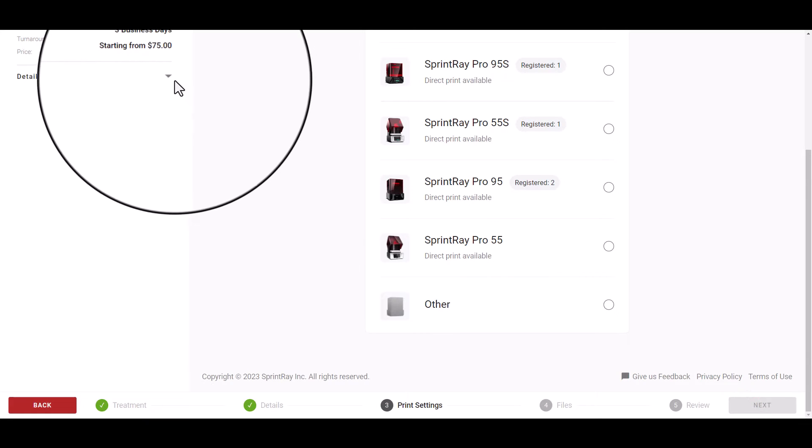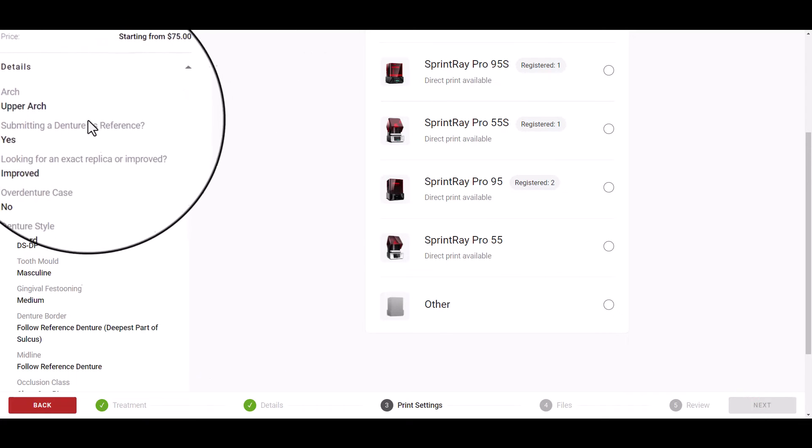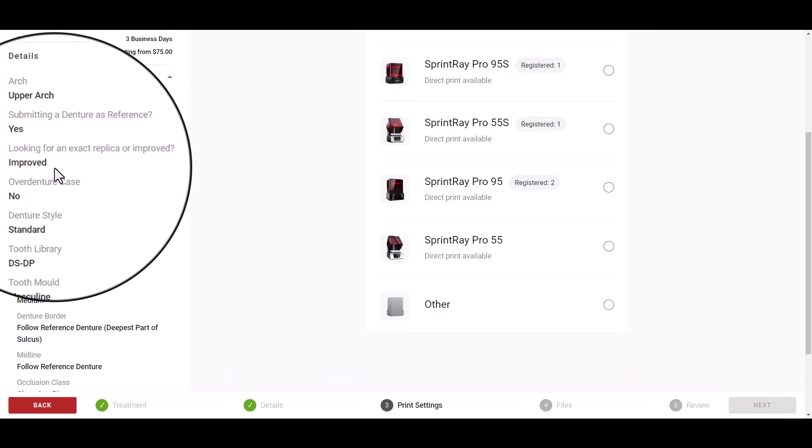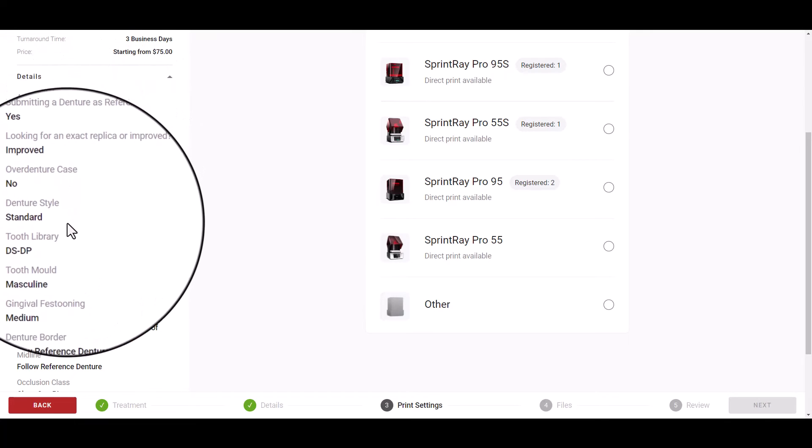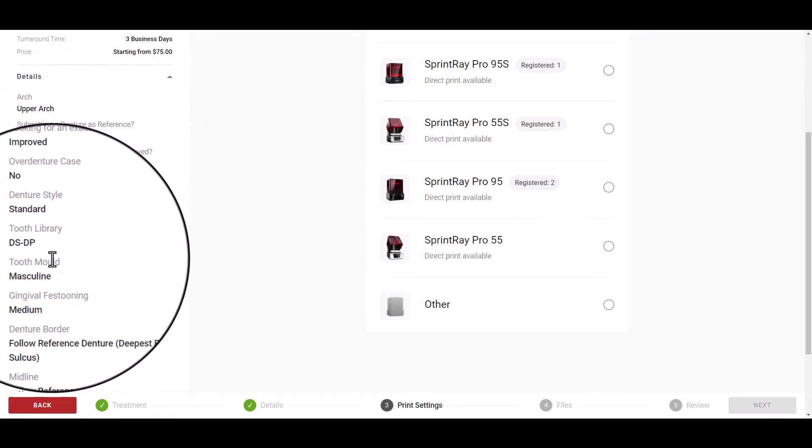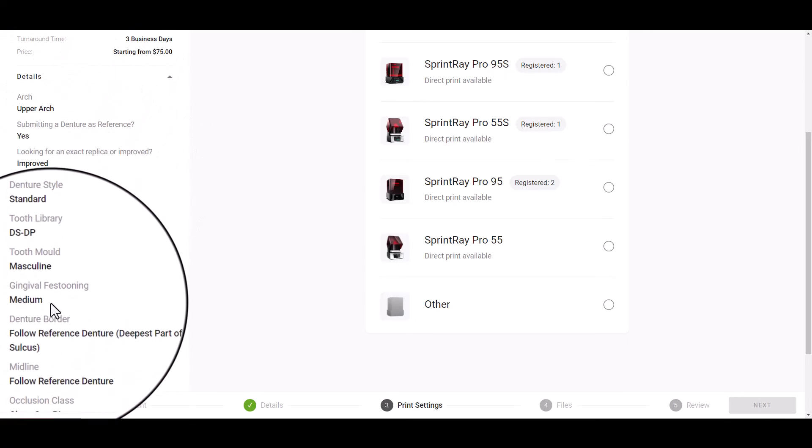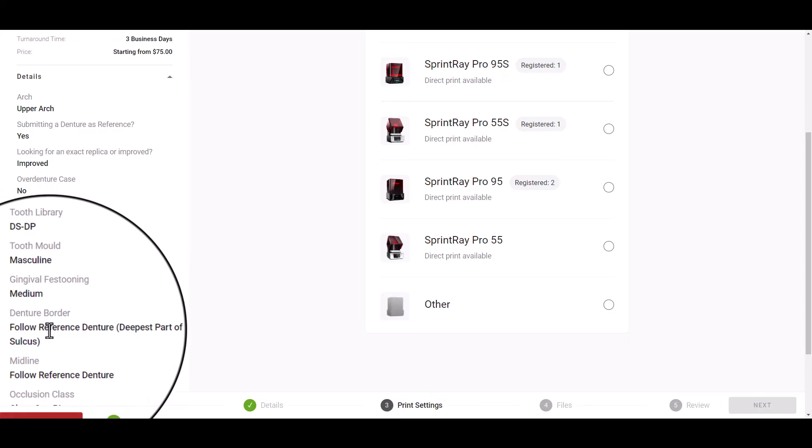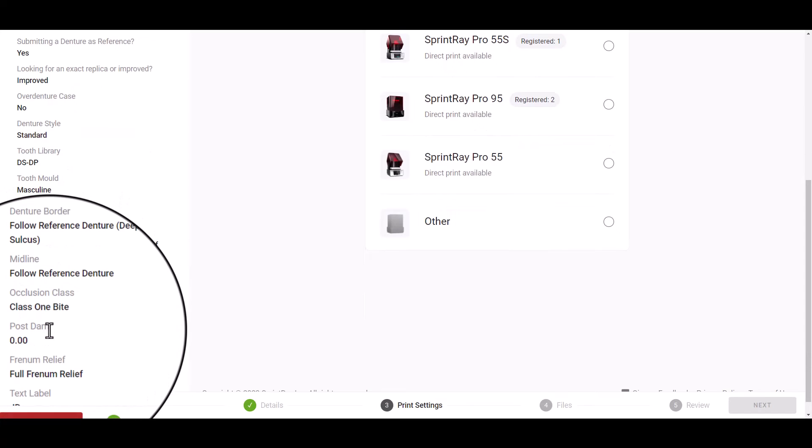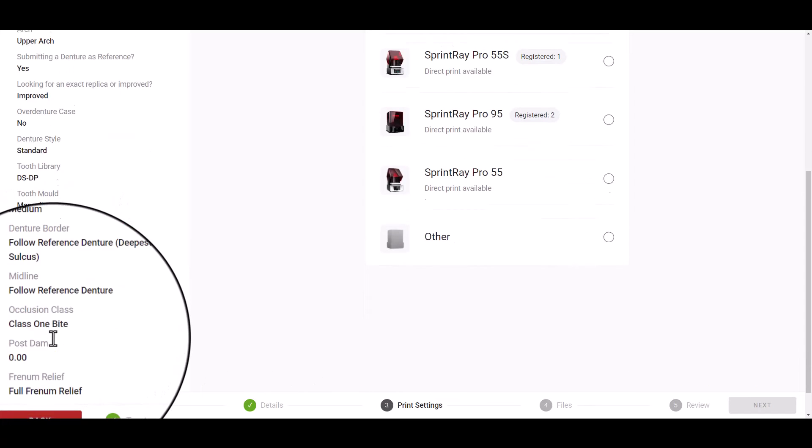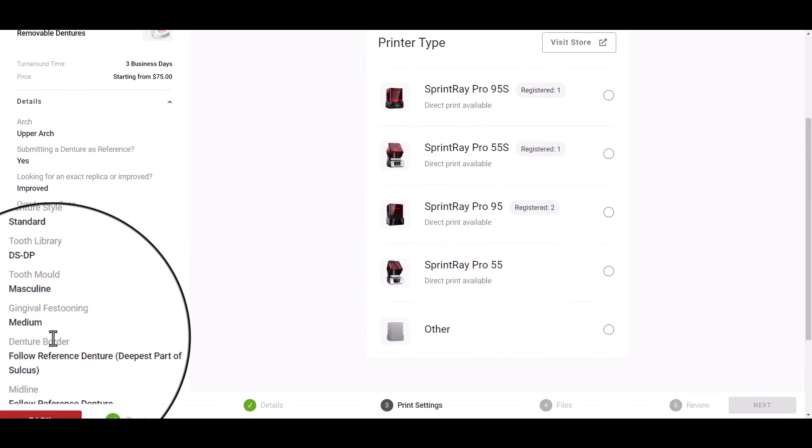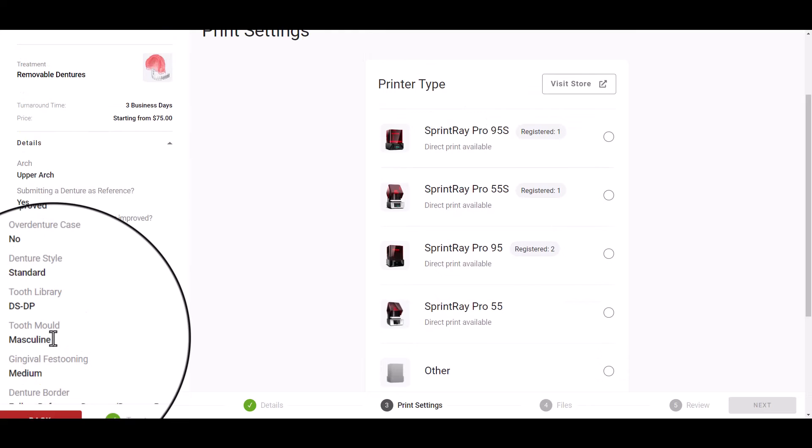As you progress you can view any details you've selected using the drop-down on the upper left-hand side. This will show you any of the design options you have selected as well as any patient specific information you have input.